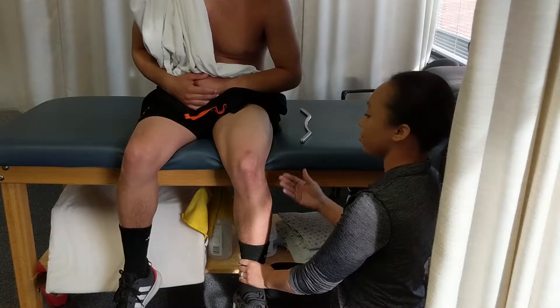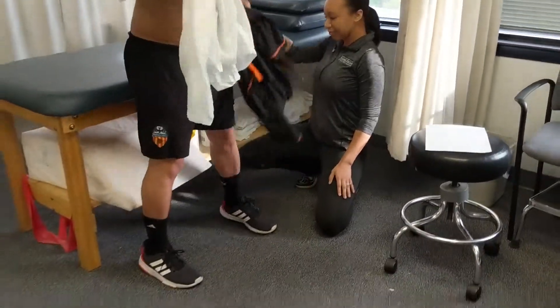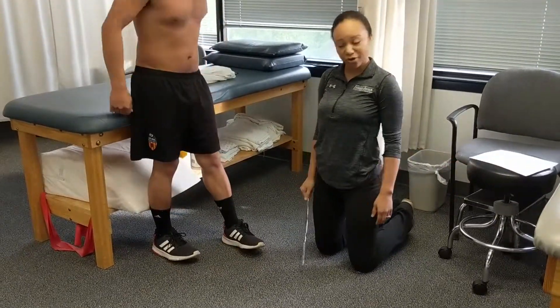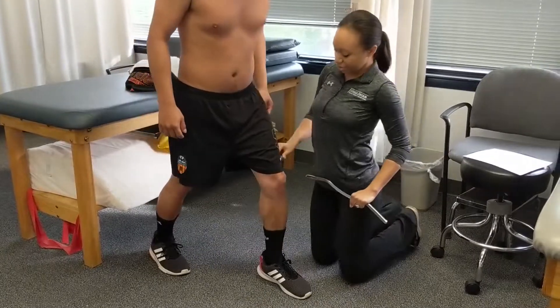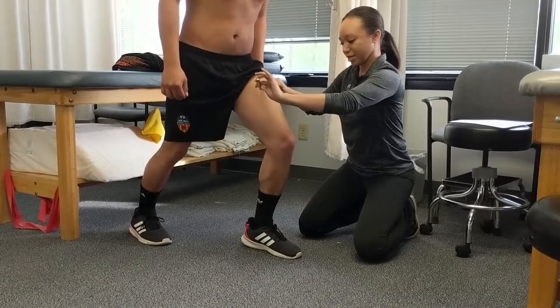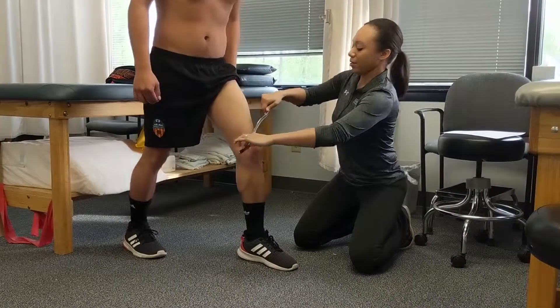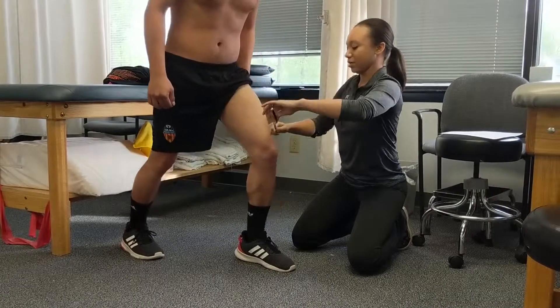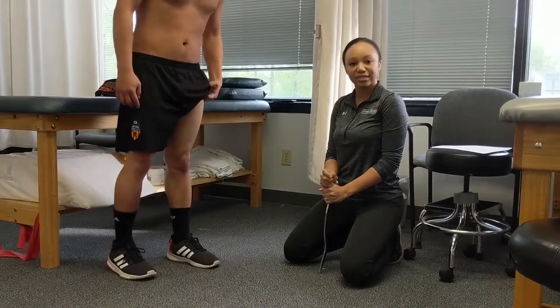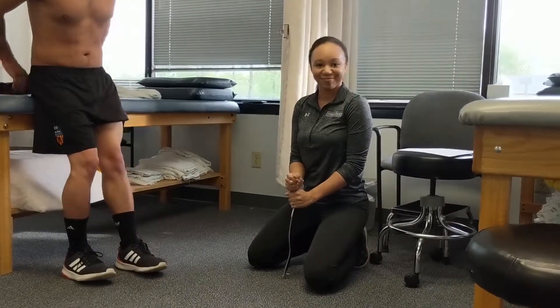Another progression — after a few sessions he'll progress up to standing. Lunges are a nice way to add some functional progression. He gets into the lunge position, we expose that area, and as he lunges you can do that same kind of pin and stretch technique, then come back up and stretch. Same kind of principles — just light pressure, work until you see that pinkening of the skin. There shouldn't be any pain response, and then you just progress and set them up with a nice home exercise program. Thanks.